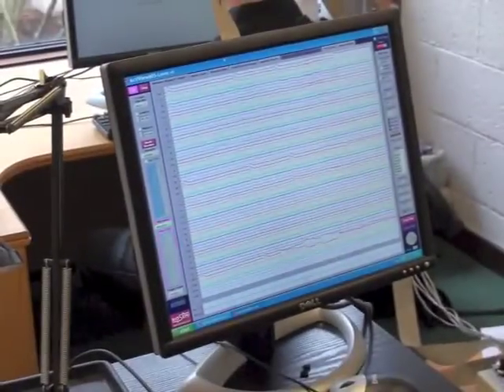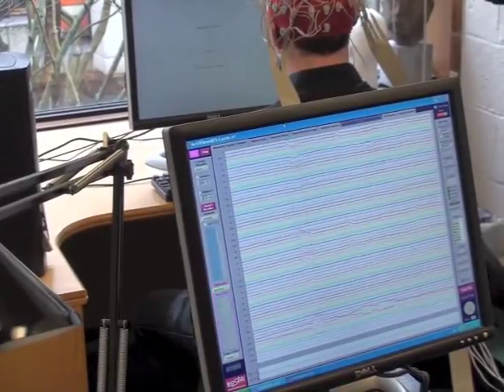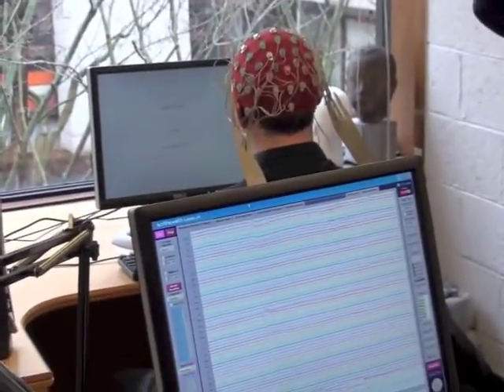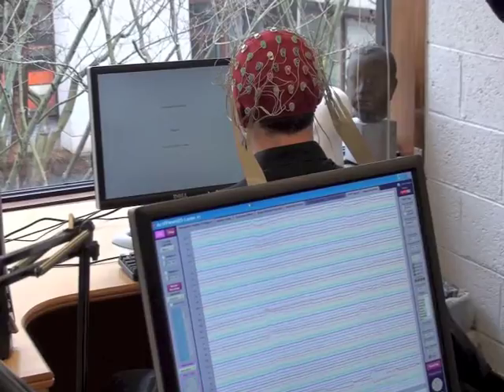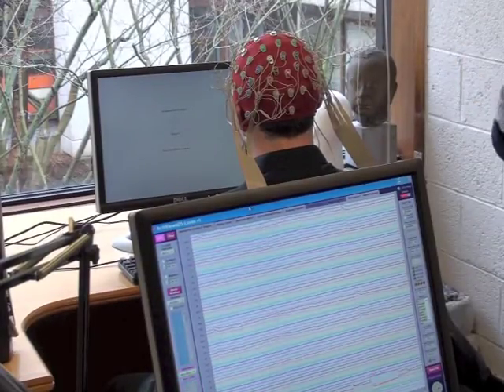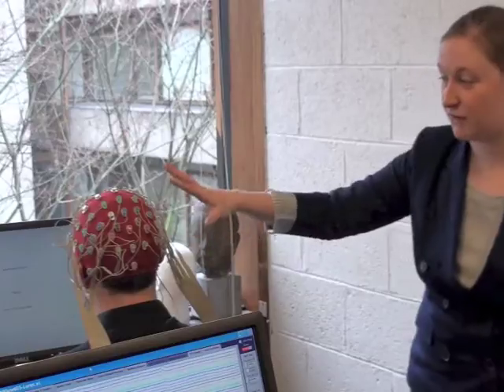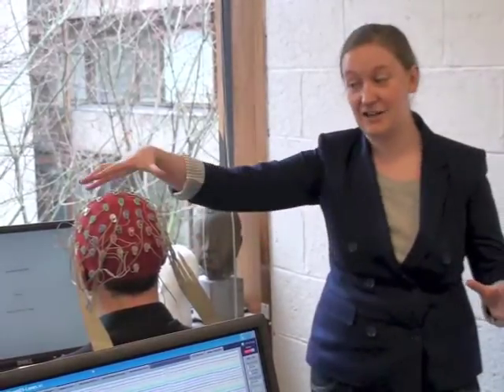At the moment, if you're reading EEG papers before you do this, you'll be confused because it's saying data was referenced to something. You're measuring here the difference in voltage between each electrode and a reference at all times. Okay, that's what you're measuring, and it will say data was referenced to X electrode or to the mastoids or to the knee. You can reference it to anything. You don't need to worry about that at all during recording with this system. This system just references each electrode to every other electrode, or to CMS and DRL, that's fine.